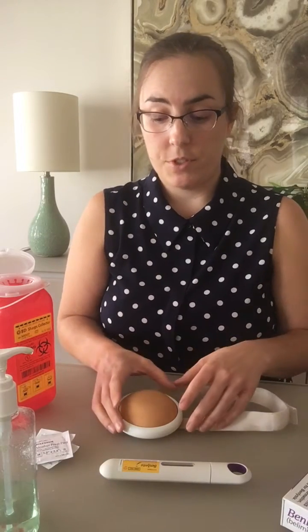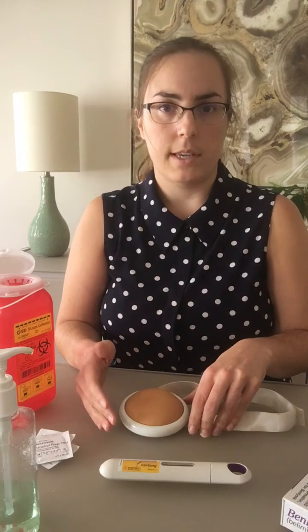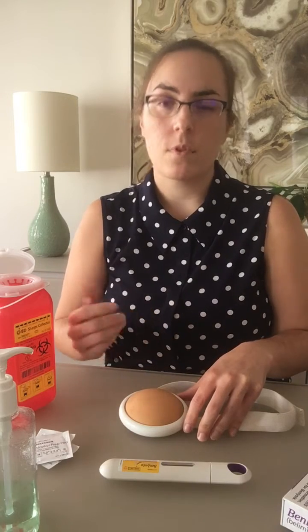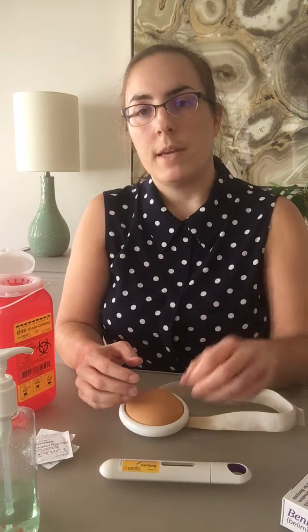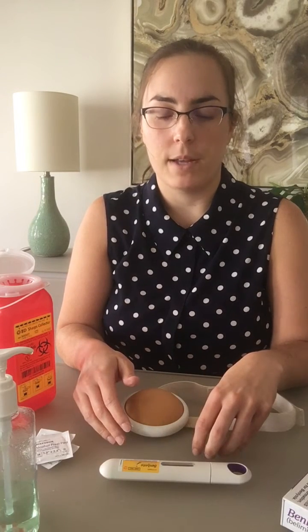Then we have to select a spot to inject. The medications are typically injected in the belly or the thighs. You're going to want to rotate sides. If you're injecting in the abdomen, make sure that you inject at least an inch away from the belly button.